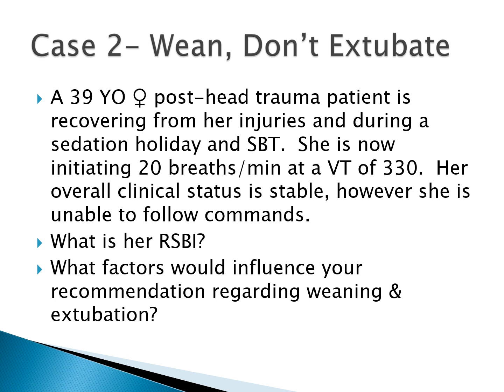If you were to do the Rapid Shallow Breathing Index calculation, we'll do that in a minute. But her overall clinical status is stable. However, she's unable to follow commands. So what is her RSBI? Numerator is 20, denominator is 0.33.